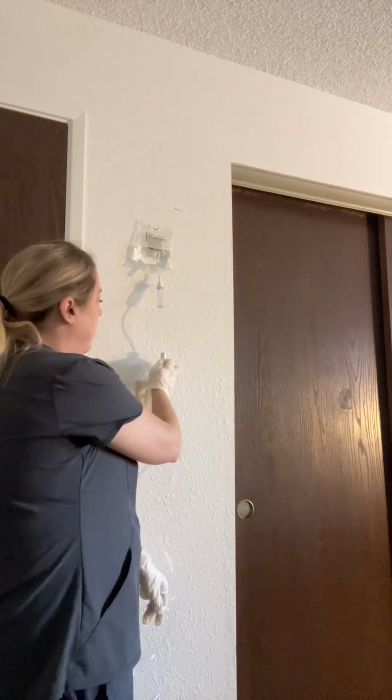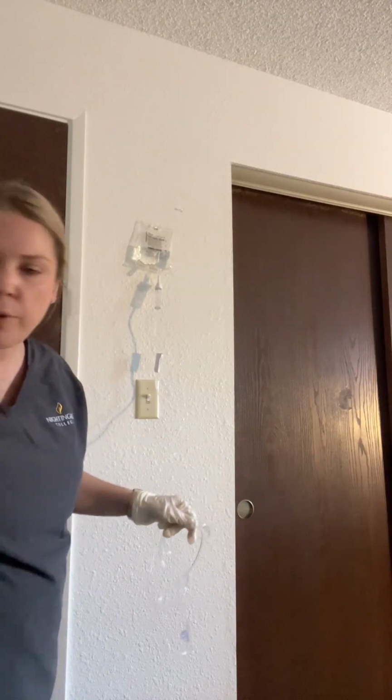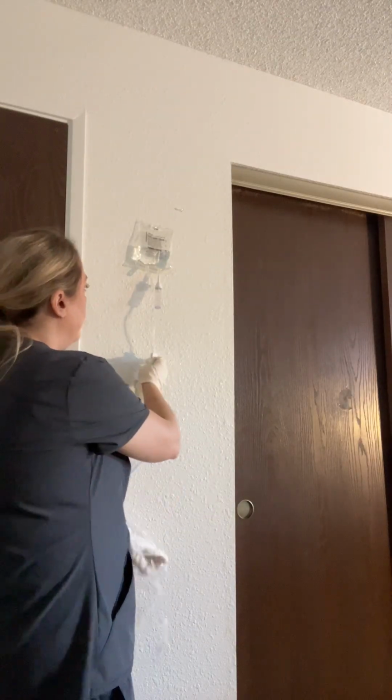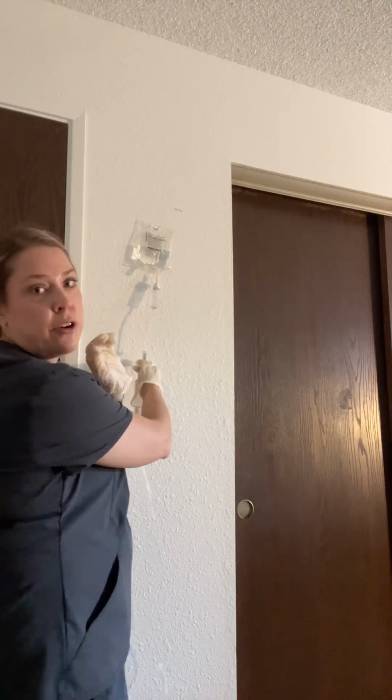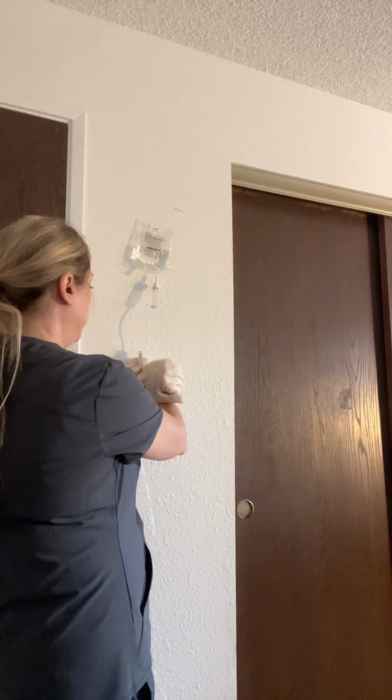Okay, the bubbles are all out, so we would attach the adapter to our IV at that point. Now we are going to count our drip chamber here for 1 minute to make sure we have 38 drops. And we are good to go.